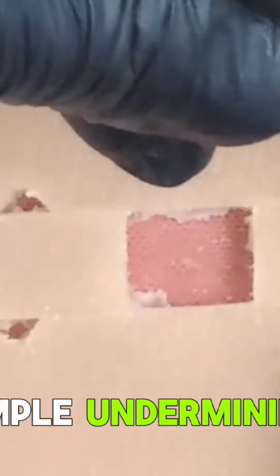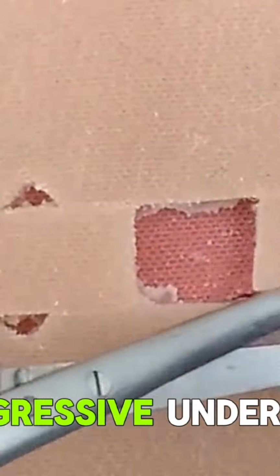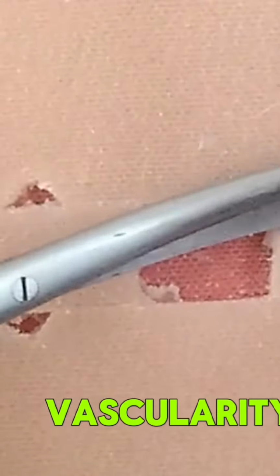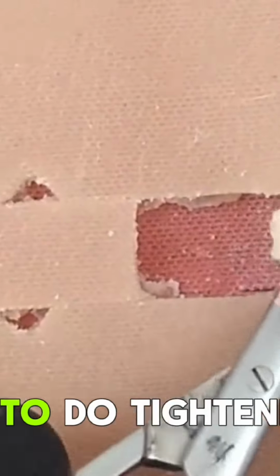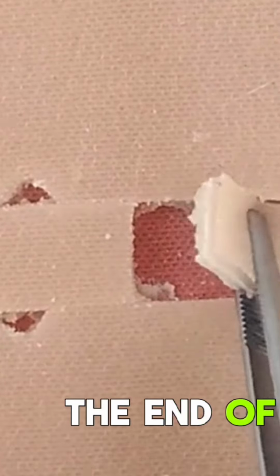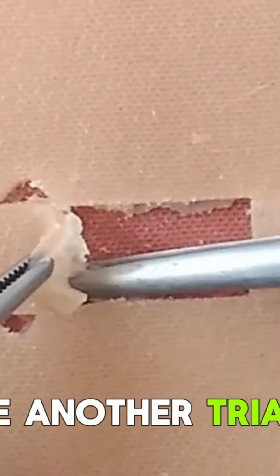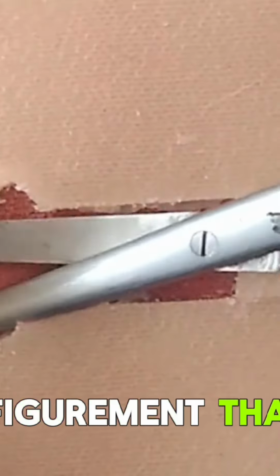Simple undermining to be able to release my flap, and I try not to do aggressive undermining so that the flap maintains good vascularity. I move the bilateral advancement flap to the center to start taking stitches in the middle to do tightening and closure of the wound. And if at the end of the edges there is any dimpling or any dog ear, I try to make another triangular incision at the ends to avoid the disfigurement that will occur.